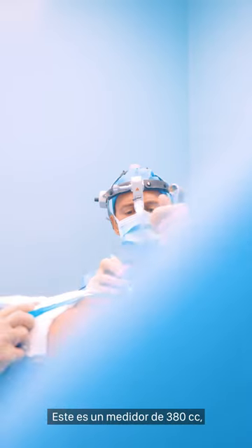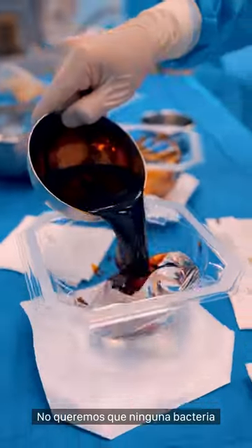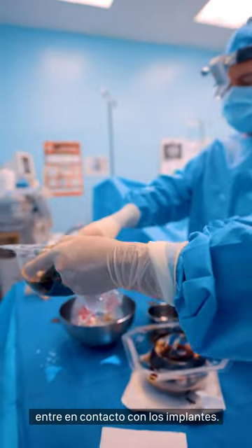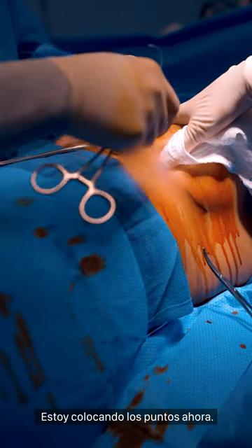This is a 380 cc sizer and it's very similar to a saline implant. We don't want any bacteria that accumulated on the gloves to come in contact with the implant. Placing with these stitches where they are.